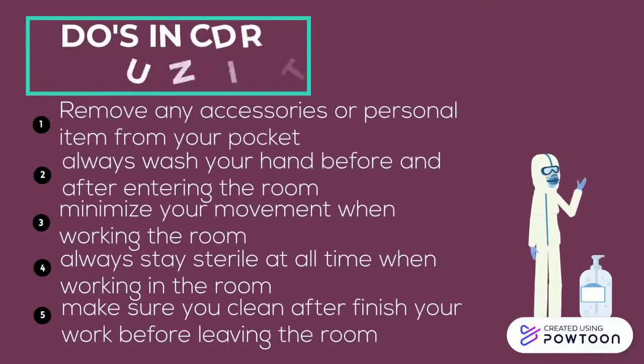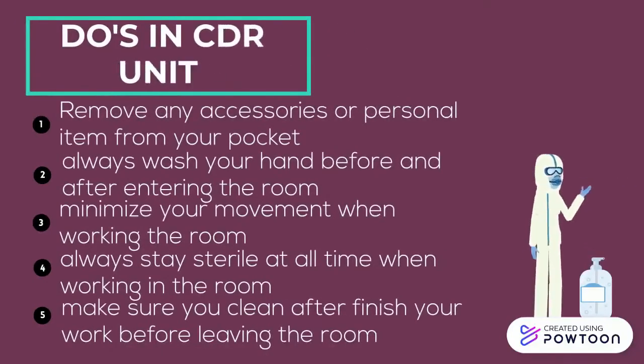Thus, in the CDR unit, remove any accessory or personal item from your pocket. Always wash your hands before and after entering the room. Minimize your movement when working in the room. Always stay sterile at all times when working in the room. Make sure you clean after you finish your work before leaving the room.